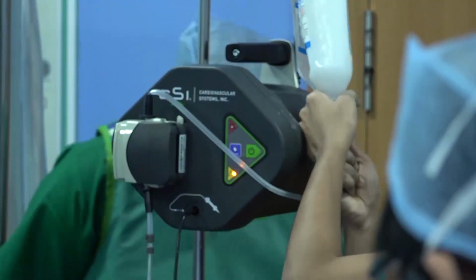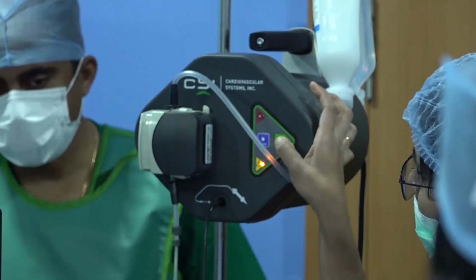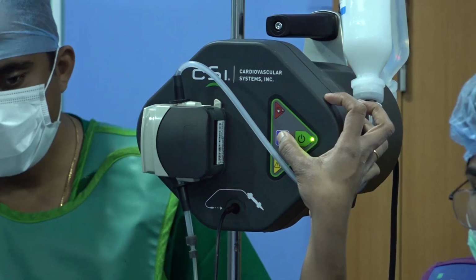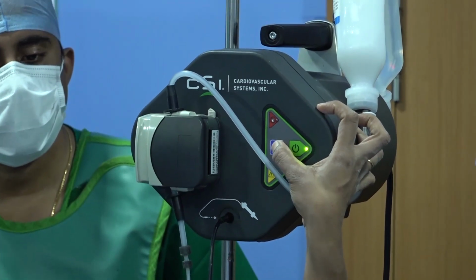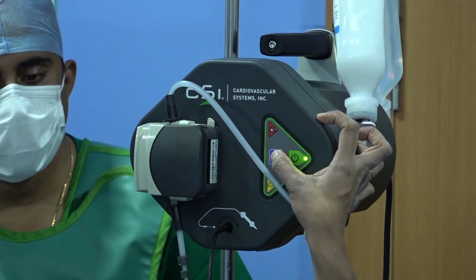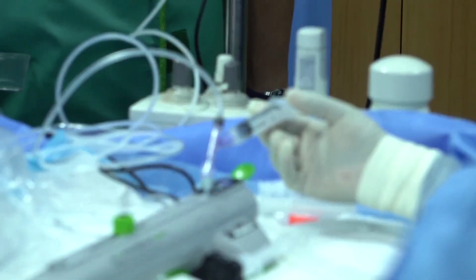Okay, so the two connections, one going onto the motor, that is the electric motor, the power comes from the pump, and the second one is basically for the purging. We have 500 cc, ideally we should have taken a 1000 ml bottle, but we have two 500 cc bottles with 10 ml of viperslide inside each of these. Now we are trying to flush it and get the thing ready, by the time we'll have the Viper wire going in.